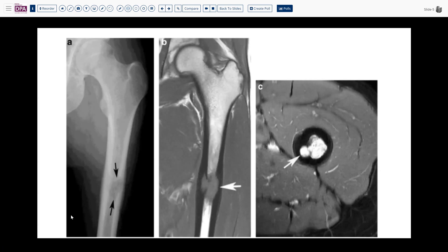On the plain film on the left, we have a lytic lesion with somewhat irregular boundaries, a second shadow with some destruction of the cortex, thinning of the cortex, and elevation of the periosteum, which appears fuzzy and hazy. On MRI, the lesion is iso-intense with skeletal muscle, indicating a tissue component.